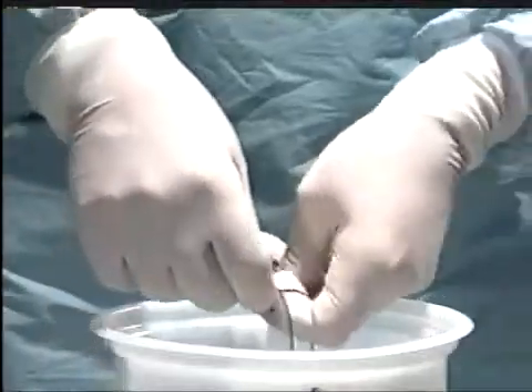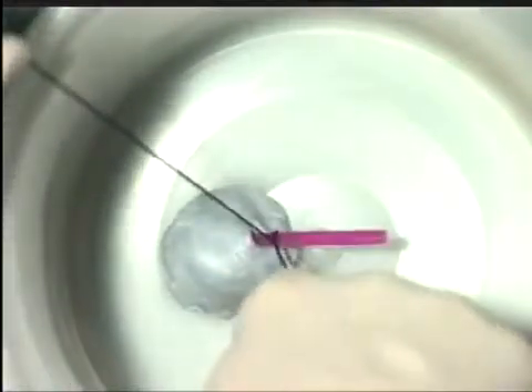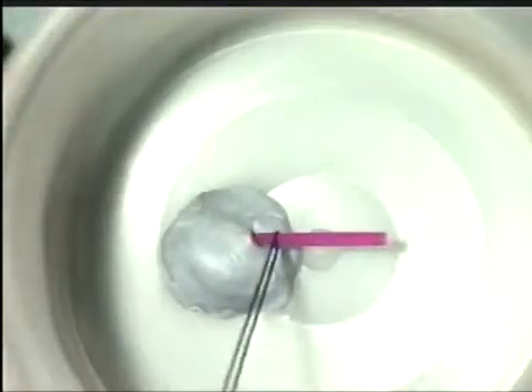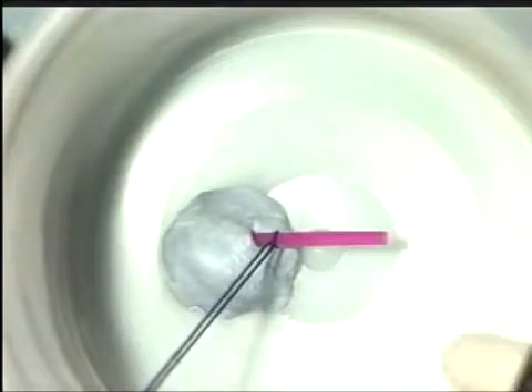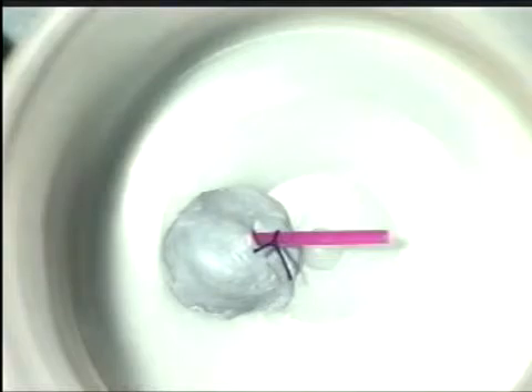Do a third throw for security and snug it down. Once complete, you are in a position to cut the suture. Ensure that no tension is actually placed on the vessel itself at any time.